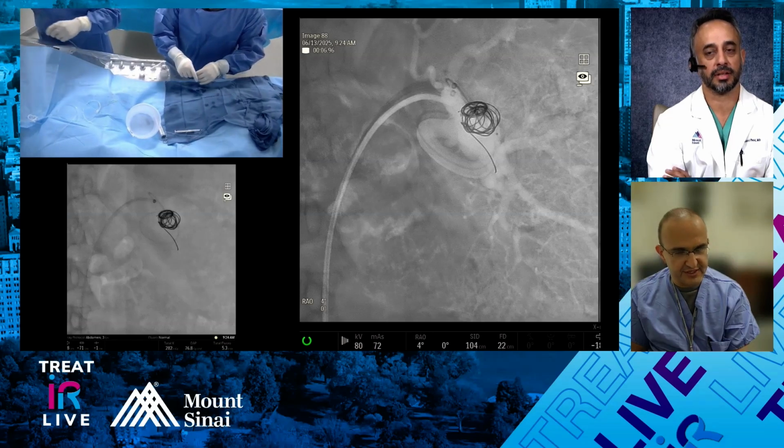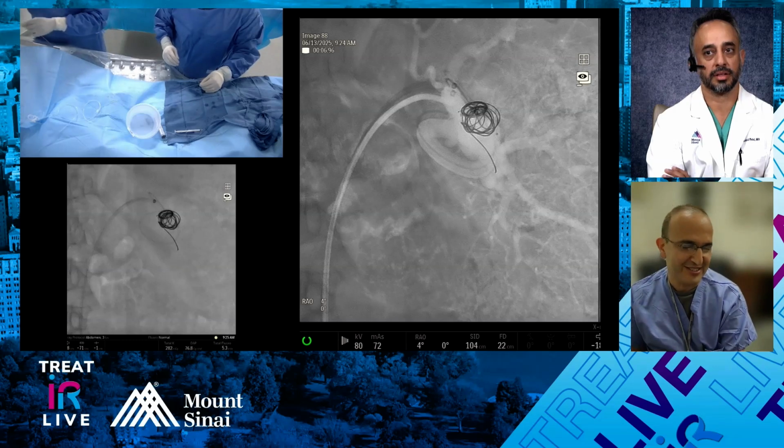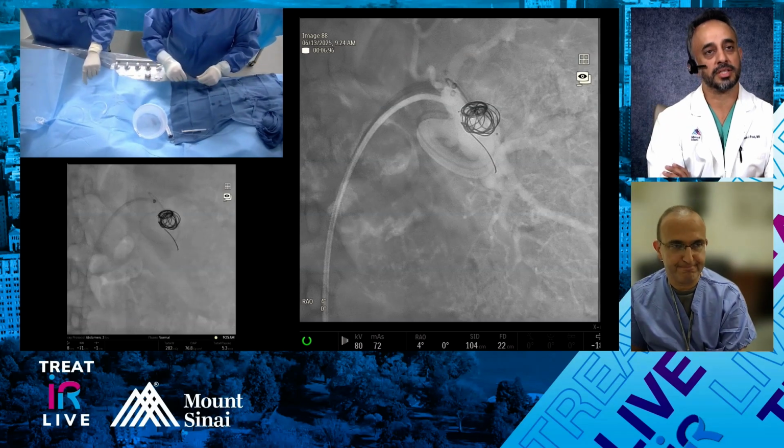I would like to emphasize the nitinol wire is very useful, because usually it's just the fellow, but if they're really aggressive about pushing it in, you bend that proximal part and it gets really hard to push the rest of the coil in through the catheter. It'll kink on you. Or you get premature detachment, right? Especially with some of the coils. Yeah, so it is nice.